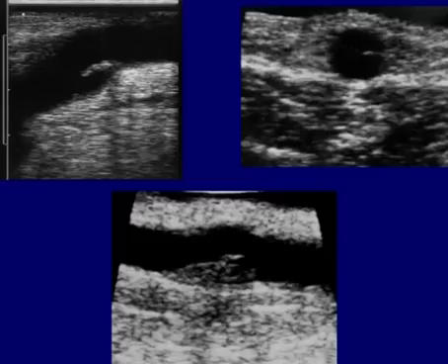Whether this was a piece of leftover valve, whether this is platelet, whether this is hyperplasia, it doesn't really matter. We just have to find it and locate it and let the clinicians know, and then they can fix this. Whether it's something primary where they just go in and cut the segment out, or whether they put another short segment in place of it, that's for them to determine. We just need to locate where the stenosis is.